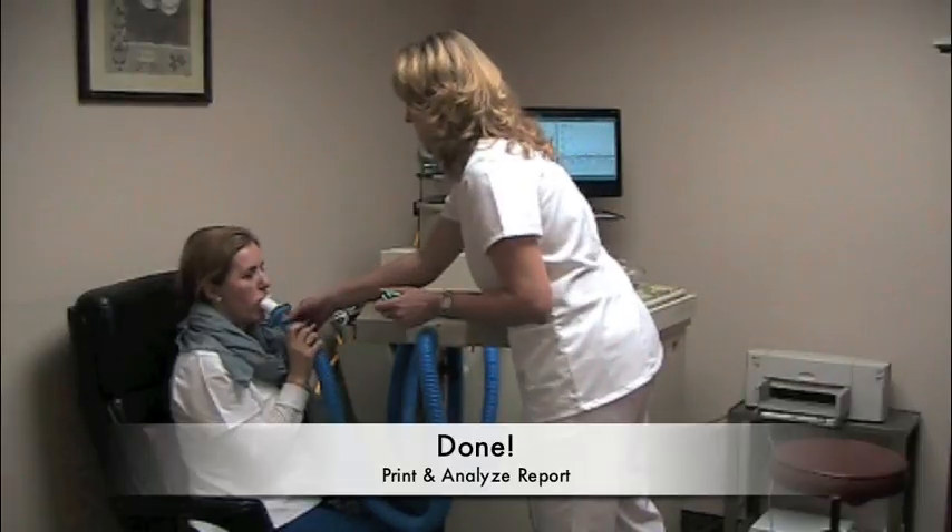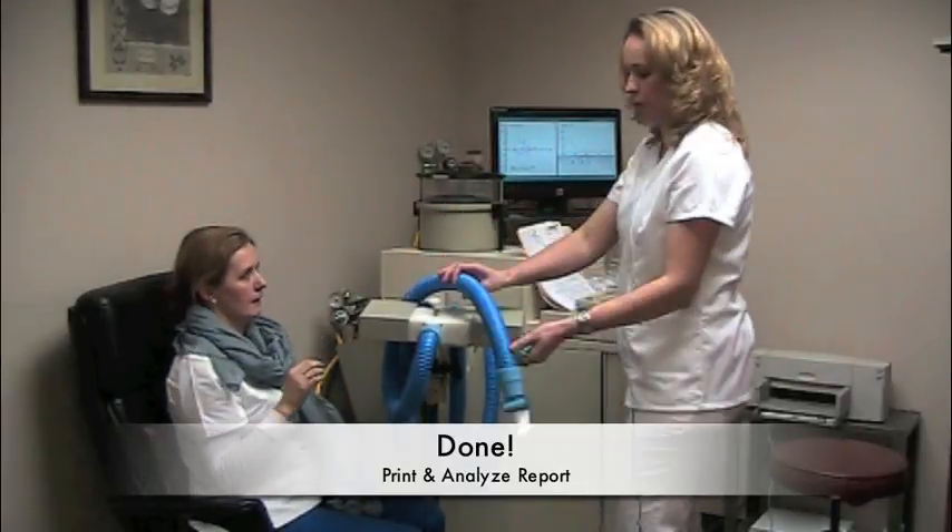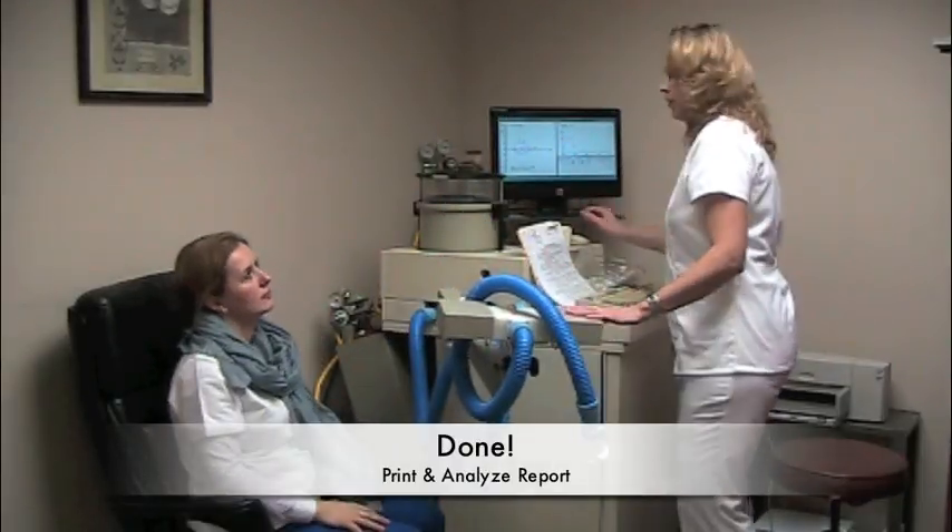The test is done. Now we're going to print the report and the doctor will review it.